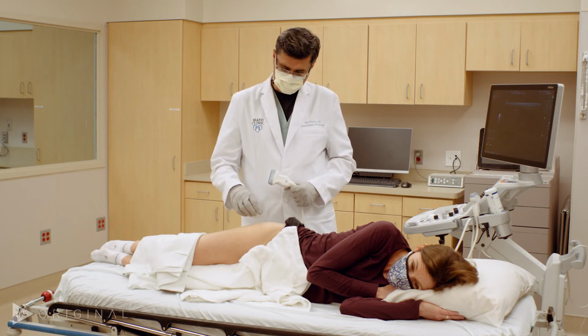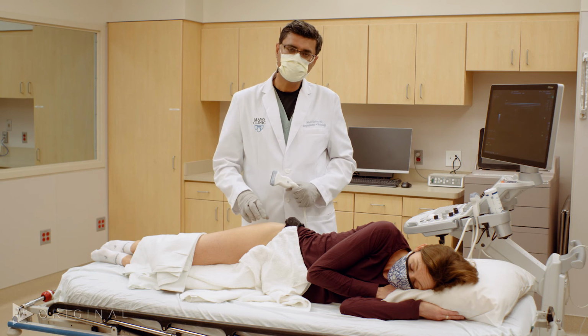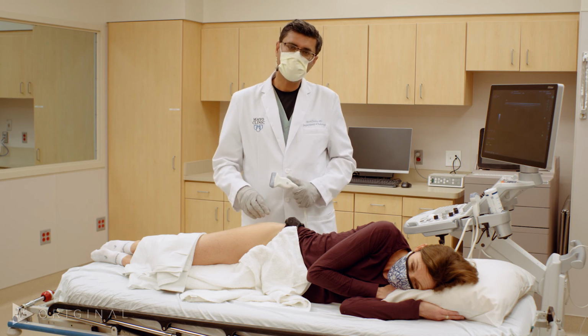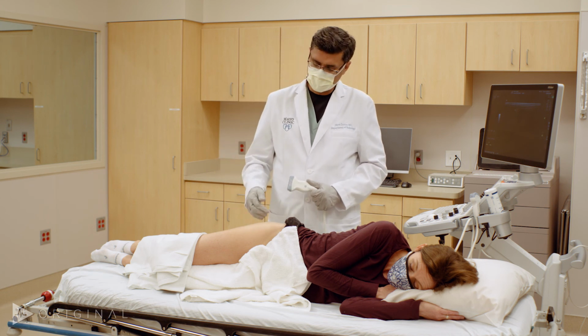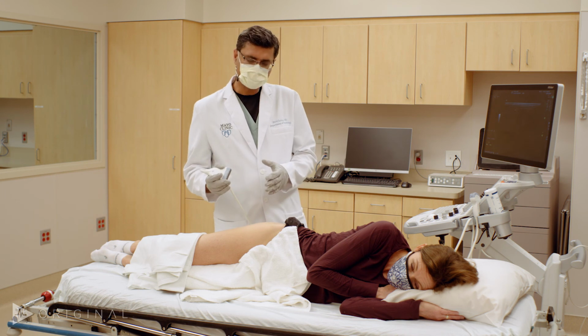So in a nutshell, we've looked at the lateral side of the hip, looked at the gluteus medius, the gluteus minimus tendons, the iliotibial band, and the trochanteric bursa. It's a fairly unique joint, but one of the key take-home points is that the complex orientation of the myotendinous unit needs to be understood to get really good images and to understand where the pathology lies in the lateral hip.